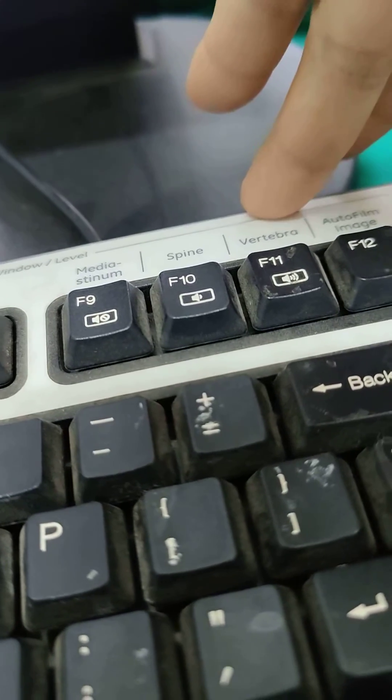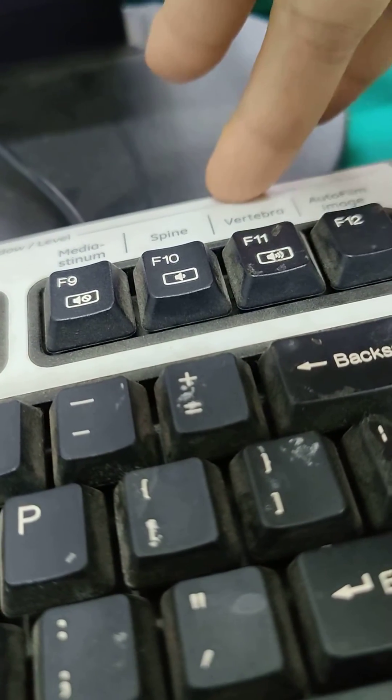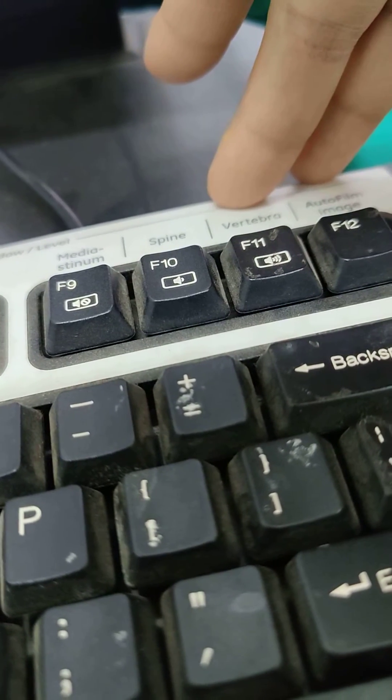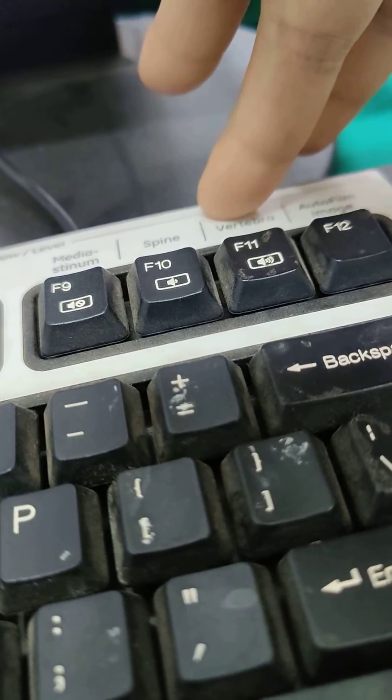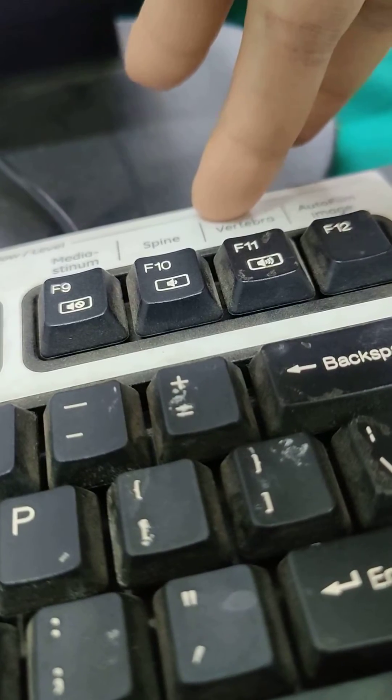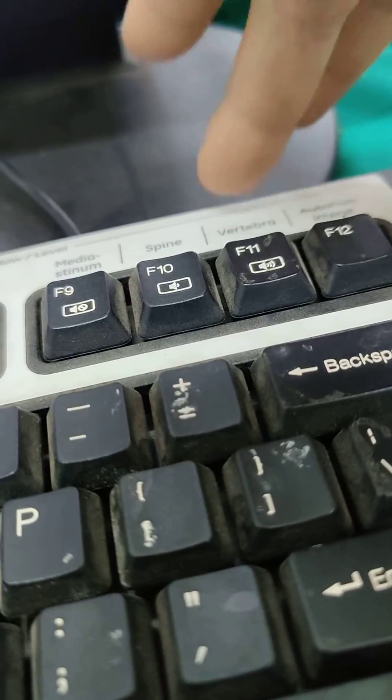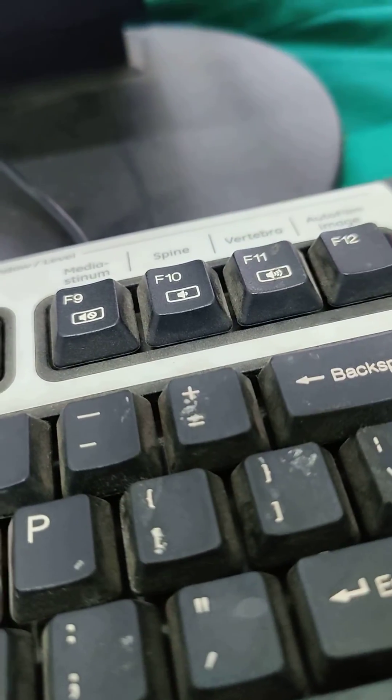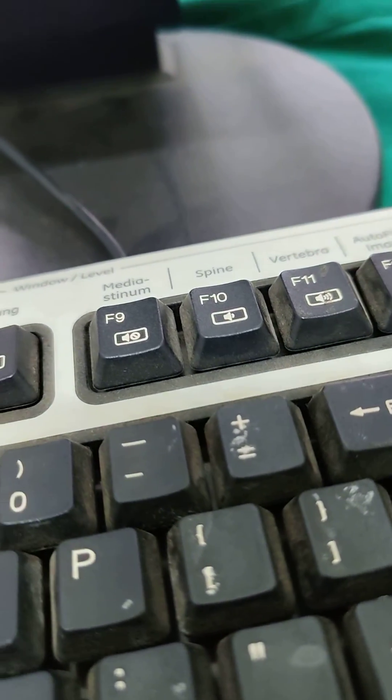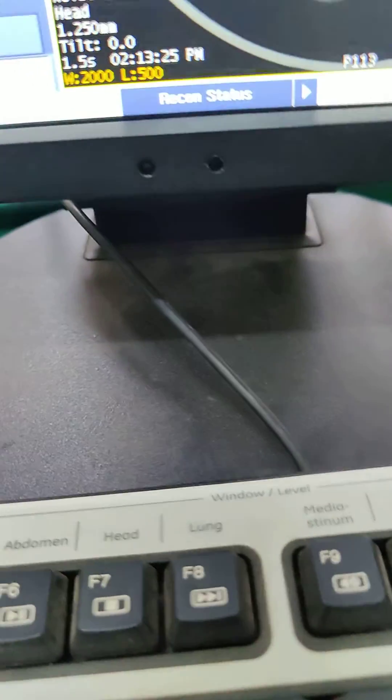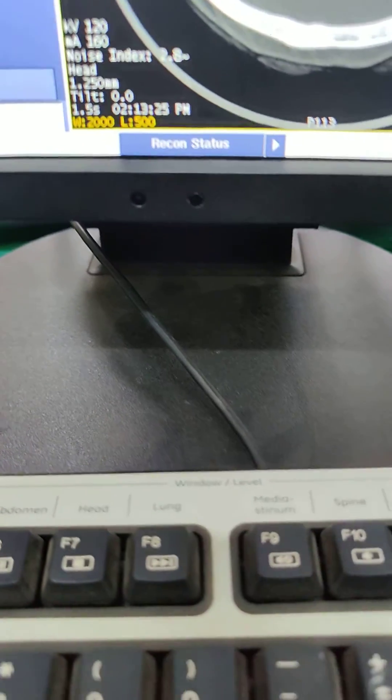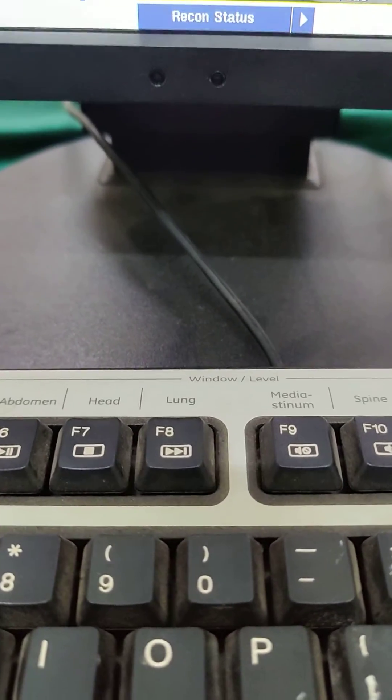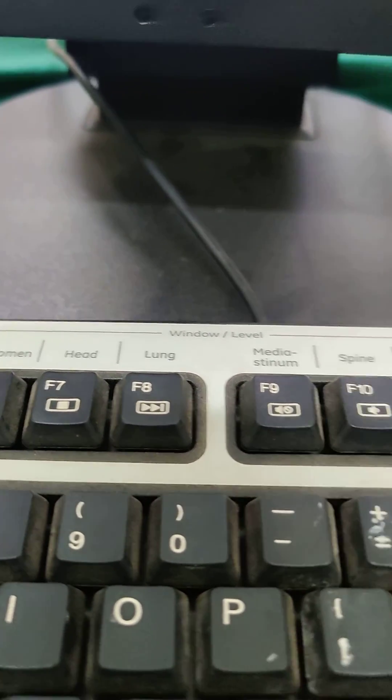Some people will even use 2400 as a window width, and then window level is 400. So again, get familiar with those numbers. That'll help you with your retro recons.